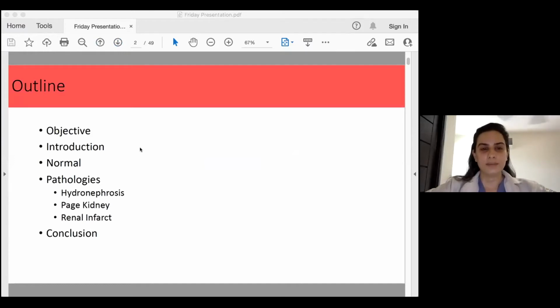The outline of my presentation today is I'm going to give a brief objective of my presentation, an introduction to the topic, talk about what the normal imaging looks like for the kidneys, and then dive into the pathologies, basically hydronephrosis, page kidney, renal infarct, and then provide a very brief conclusion, which is a summary of my findings.